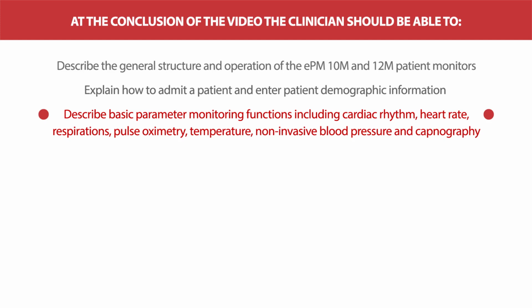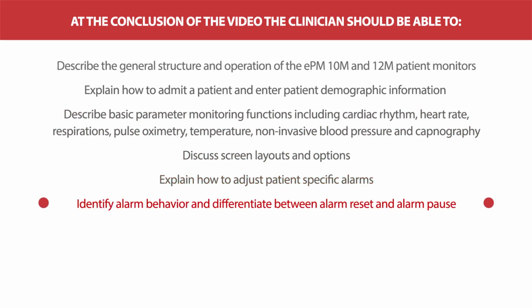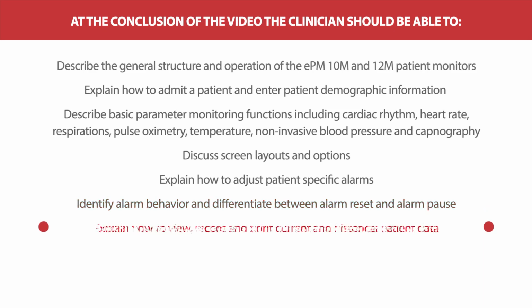monitoring functions, including cardiac rhythm, heart rate, respirations, pulse oximetry, temperature, non-invasive blood pressure, and capnography. Discuss screen layouts and options. Explain how to adjust patient-specific alarms. Identify alarm behavior and differentiate between alarm reset and alarm pause.